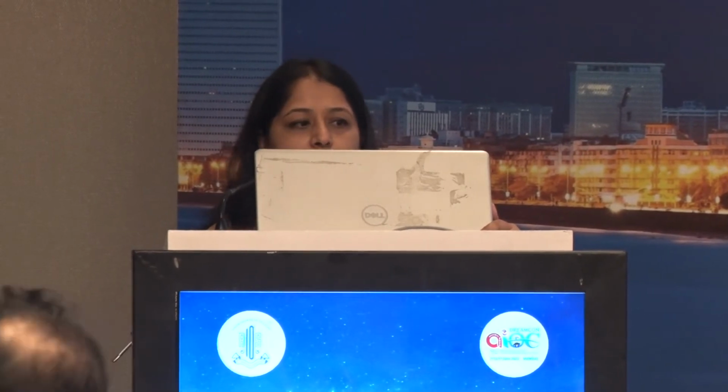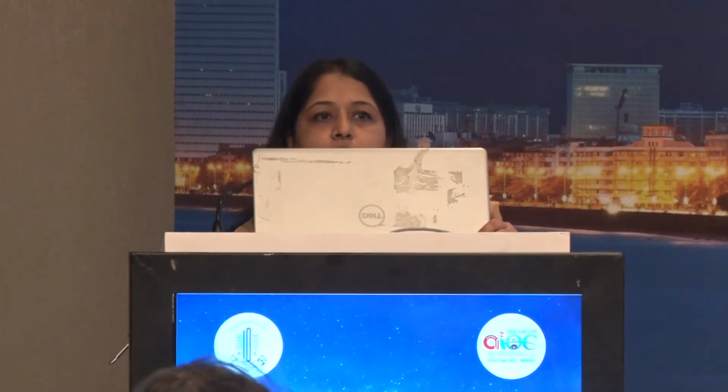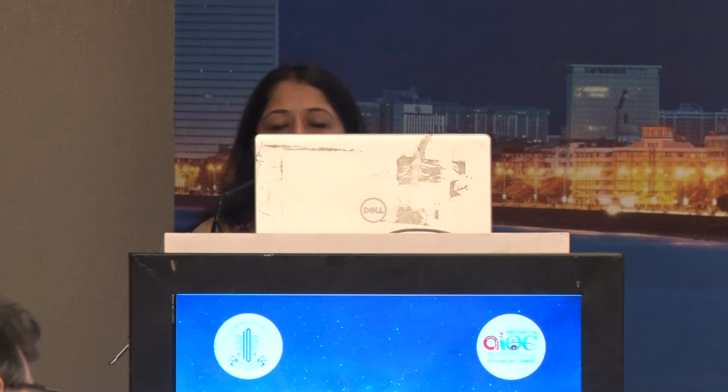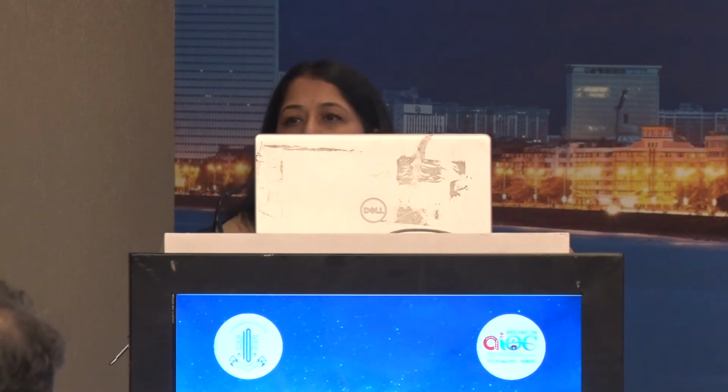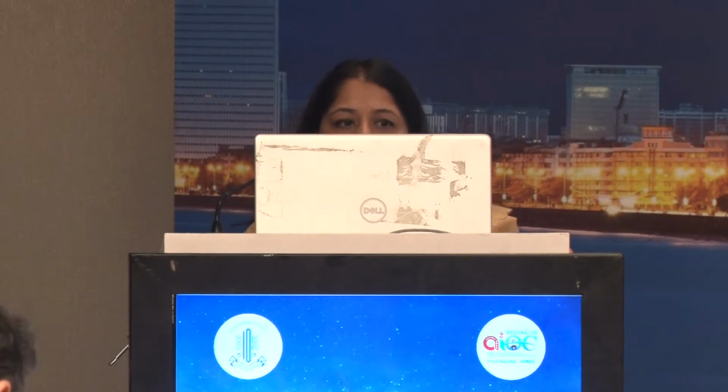I'm going to talk on fear of cloudy cornea, cataract in presence of endothelial dystrophy. Cloudy cornea gives a major challenge preoperatively, intraoperatively, and postoperatively to a cataract surgeon. The major difficulty is a clear view through the cornea to the lens.